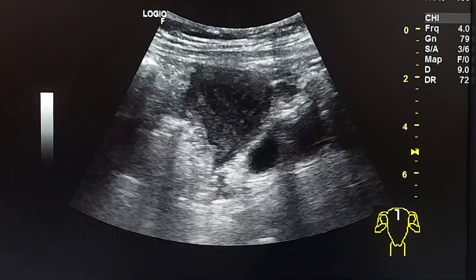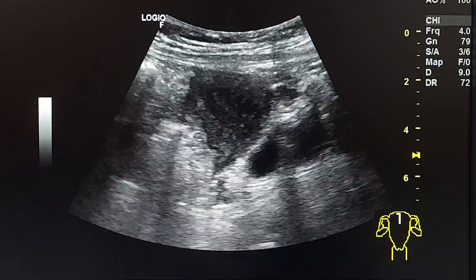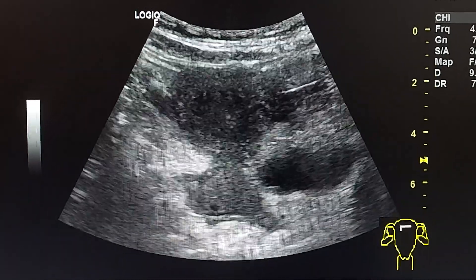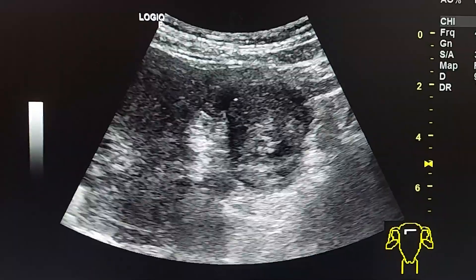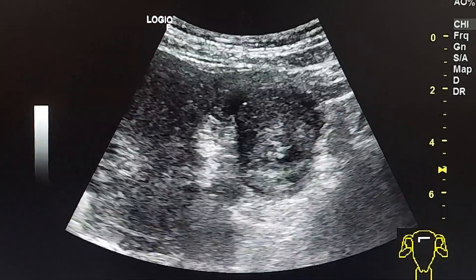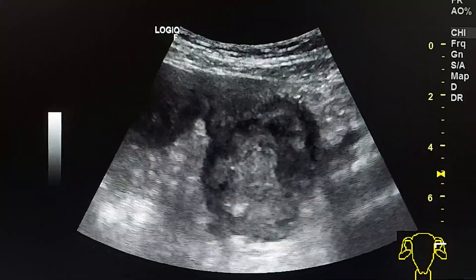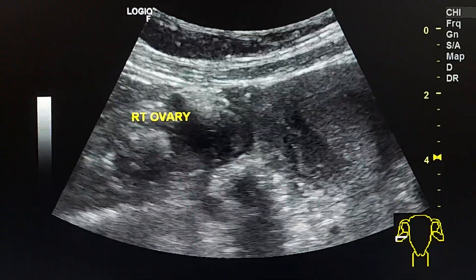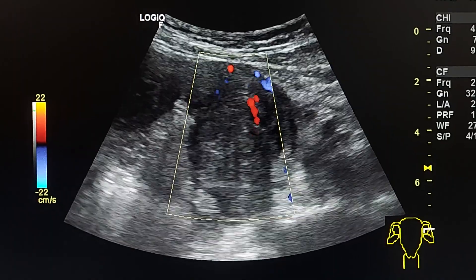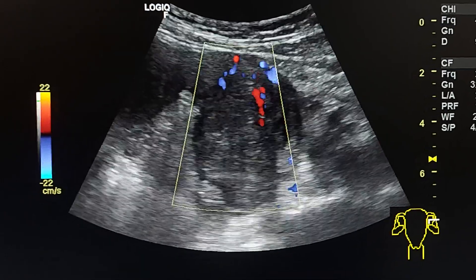This is an ultrasound case of a female patient, 40 years old, presenting with acute lower abdominal pain. This is the uterus in coronal section. In the left adnexa, we see a large solid cystic heterogeneous mass. This is the right ovary, which is normal. The left adnexal mass has flow on color Doppler.